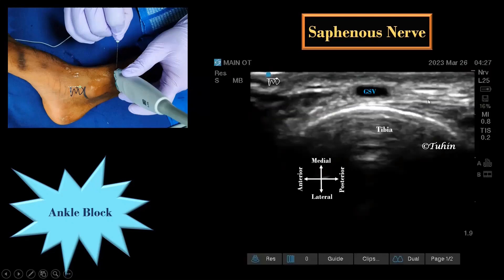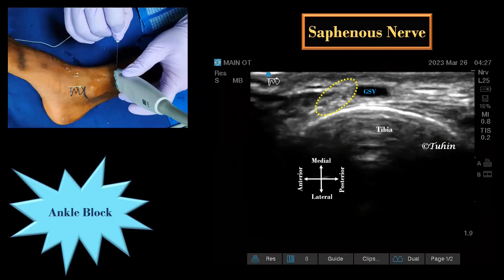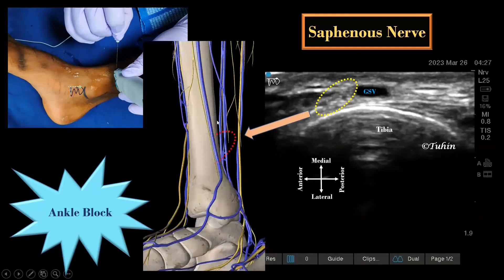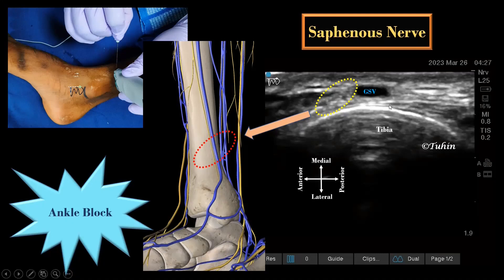For saphenous nerve block, the transducer is placed just proximal to the medial malleolus in transverse orientation. The saphenous nerve may be visualized as a small hyperechoic structure anterior or posterior to the greater saphenous vein. It is sometimes difficult to visualize because it is very small; in such cases the local anesthetic can be deposited around the vein.